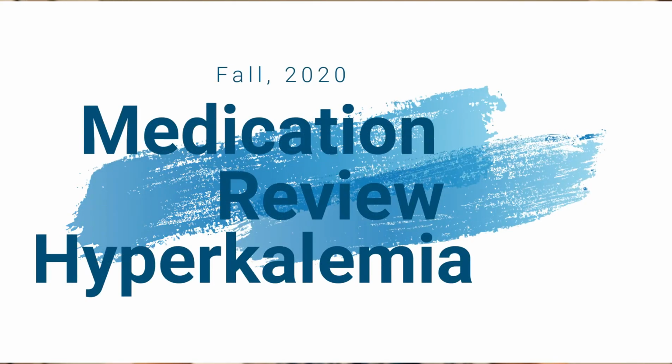The purpose of this video is to review med administration for some of our medications that we give for hyperkalemia, as well as how to differentiate some of the syringes and needles that we'll use. So one of the things that I want to talk to you about first is giving medications IV push.